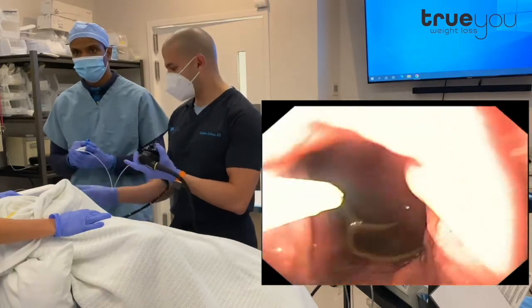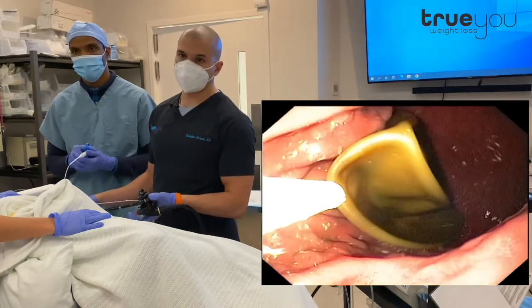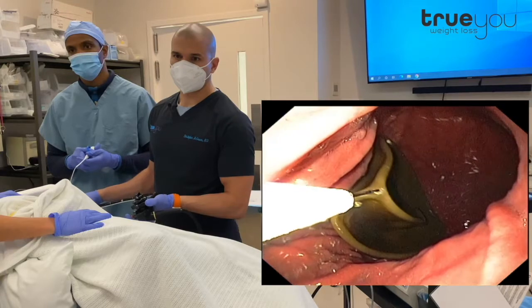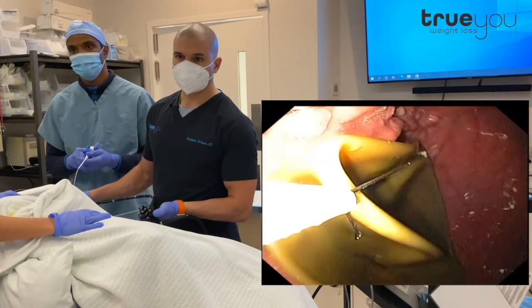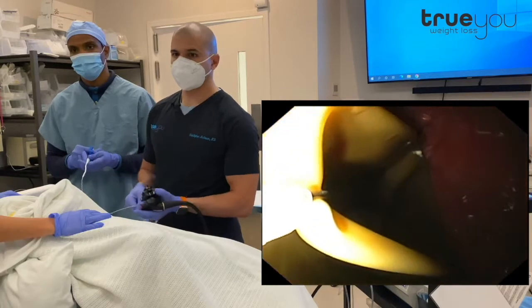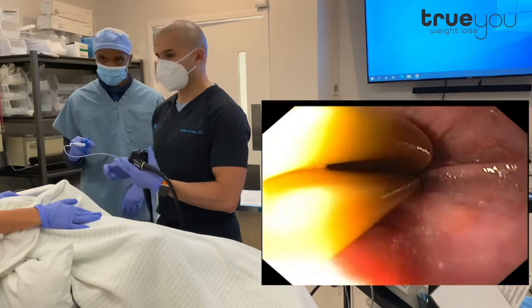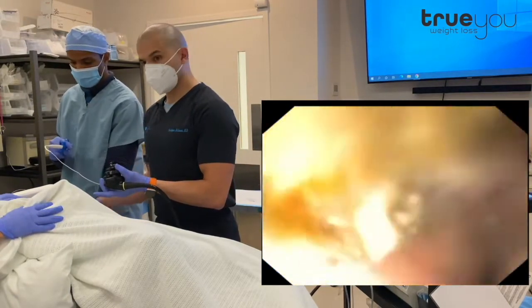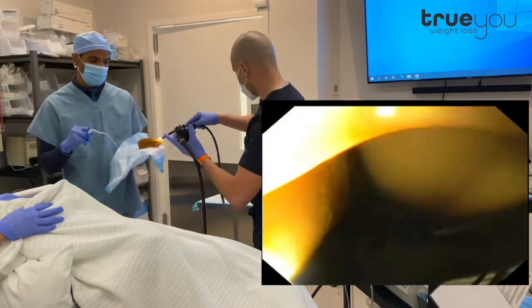Now we're using a device called a grasper. This looks like two fish hooks, and it's really going to grab into the balloon so we can drag it out. You can see the hooks close — that's locked into the balloon — and we're going to pull it straight out. Sometimes they can get hung up a little bit in the esophagus, but this one is coming out quite easily. That is the balloon right here, and our procedure is finished.